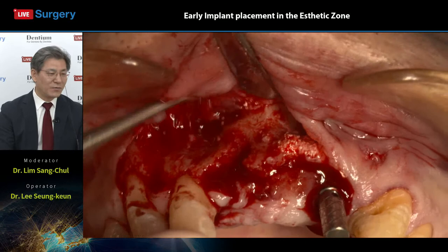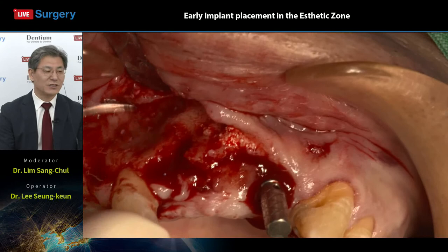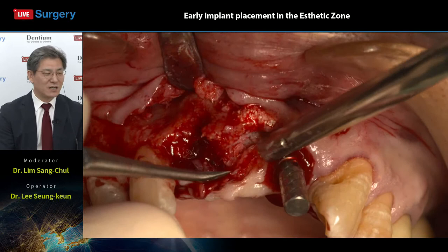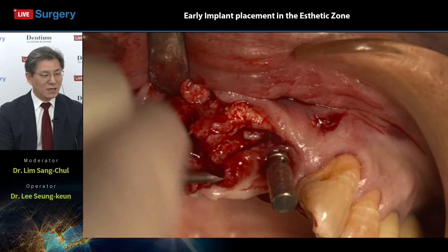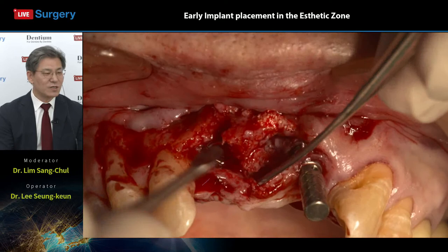Suction. Like a modified tunneling technique style. So it is not the traditional, original type of tunneling technique, but he has slightly modified it: no vertical incision, but he tried to make a space flexion underneath this number 21 implant installed area. So in the future, maybe he wants to place some graft materials, some augmentation, using graft materials underneath this mucosal flap, number 21 area.